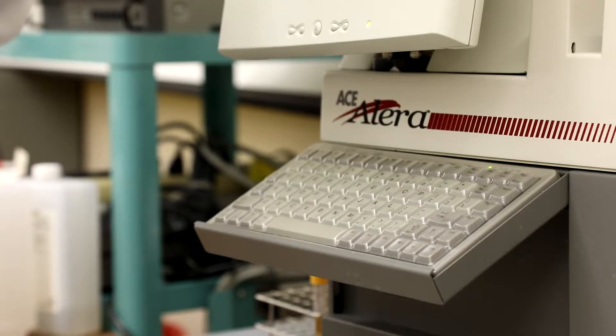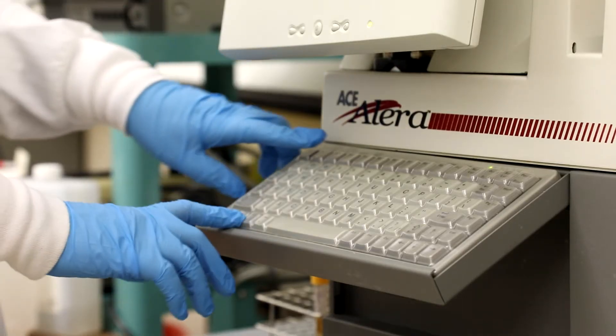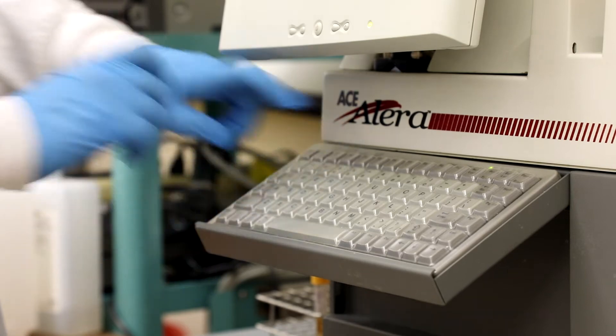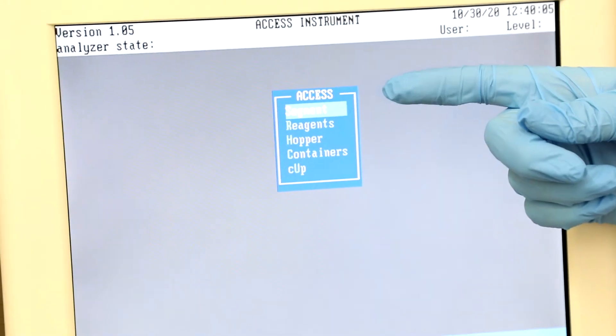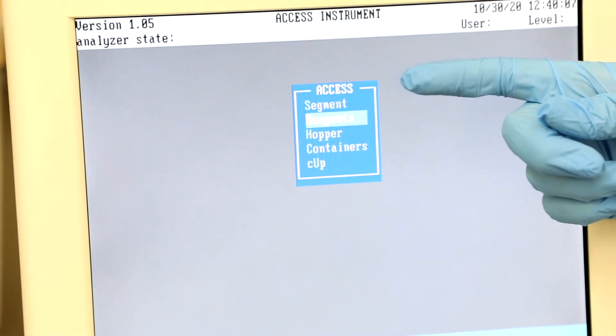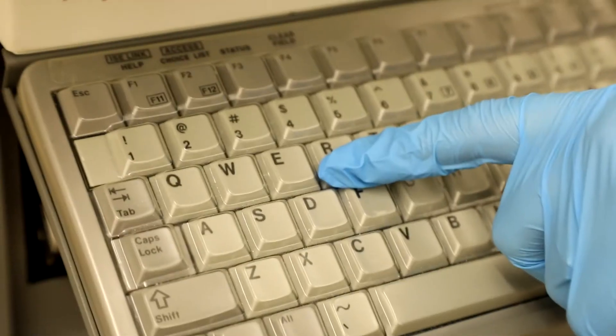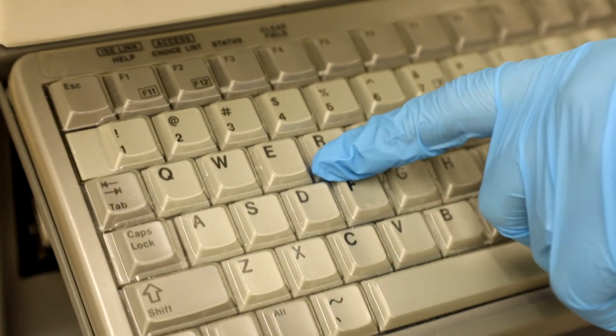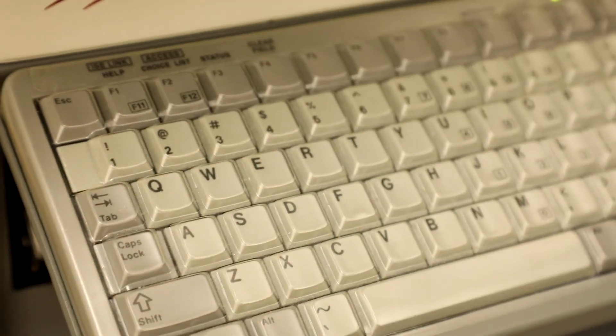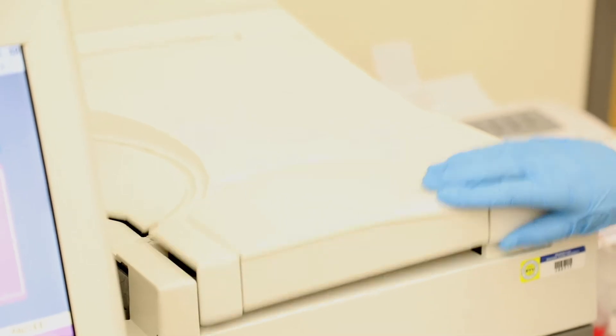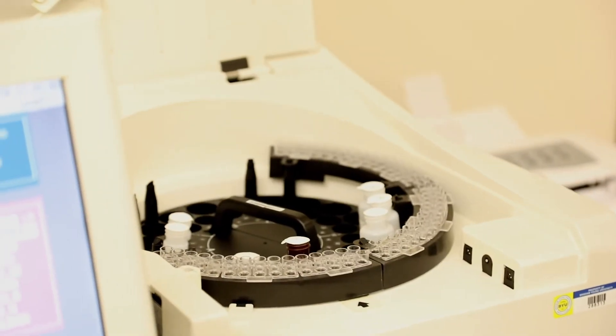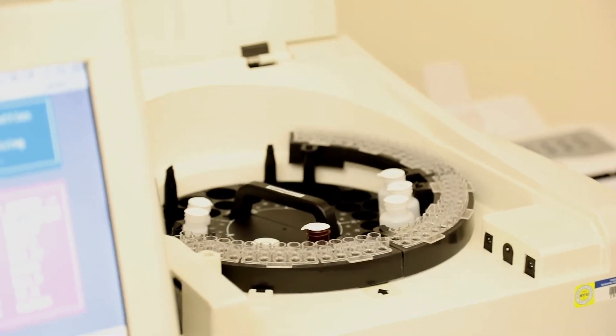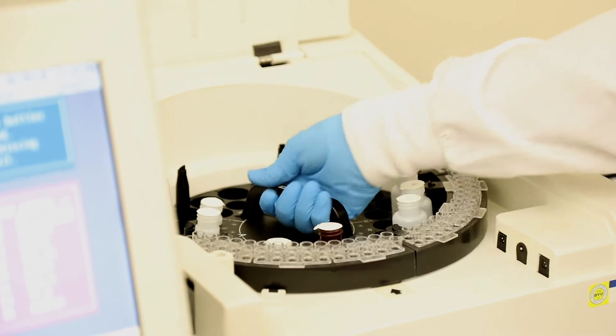To do this, bring up the Access menu by pressing Fn and F12 on the keyboard. Then select R by either hitting Enter when it is highlighted or pressing R on the keyboard. You will hear the analyzer unlock and you will be able to open the lid.